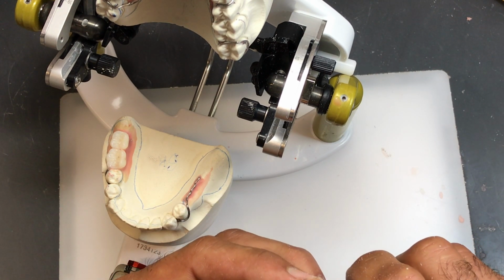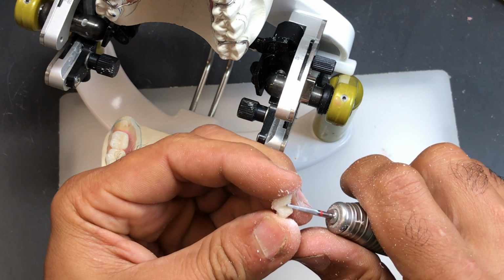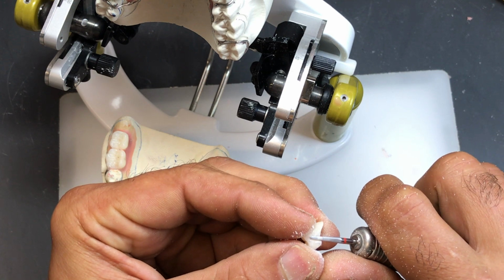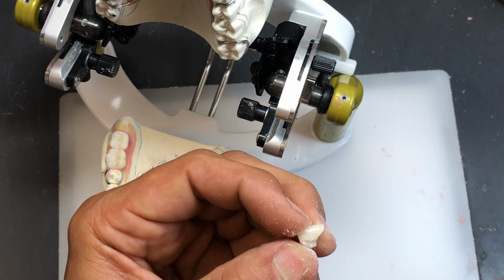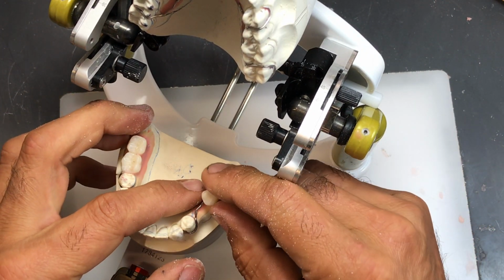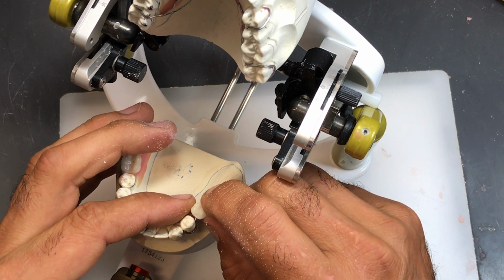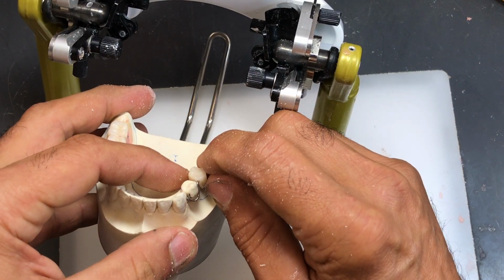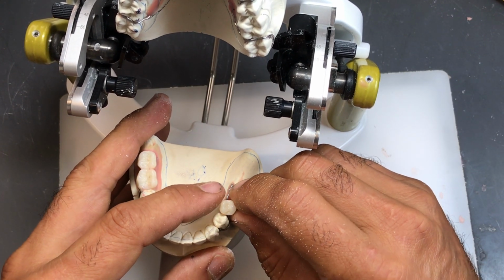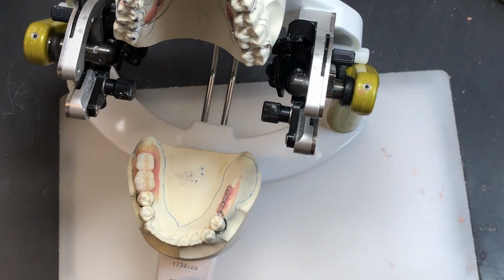And from the looks of it, the wire looks at this angle. So I'm using a very small tapered burr. Some people might want to use a disc, but this burr works pretty good. Let's see how close I am to that. So I didn't grind as much as I wanted to. I just wanted to get an idea where I'm going with this. And it looks like I'm on the right spot. Lining up the buccal marginal ridges, the mesial marginal ridges. That looks pretty good. So I'm going to go a little bit more now.